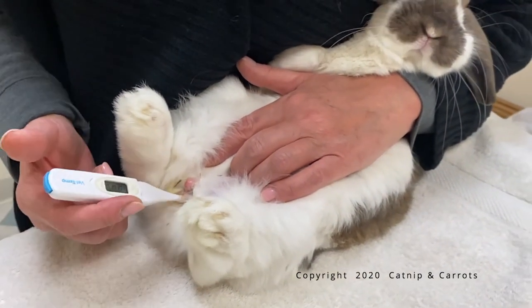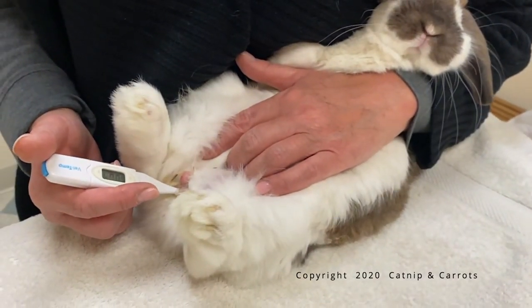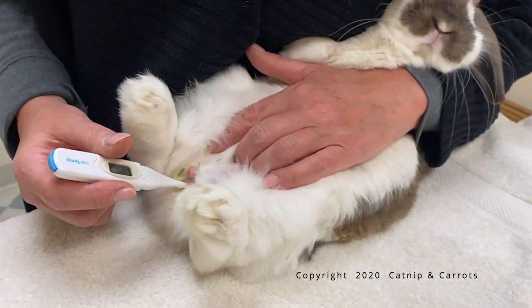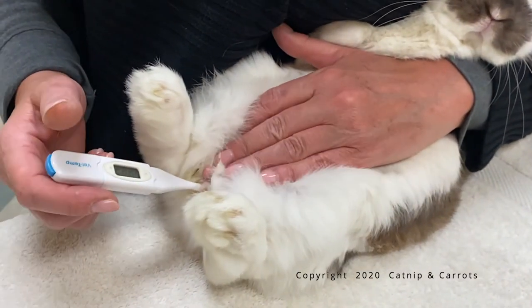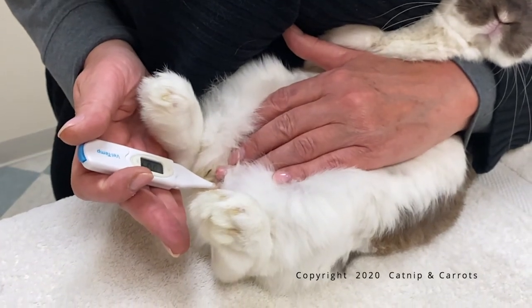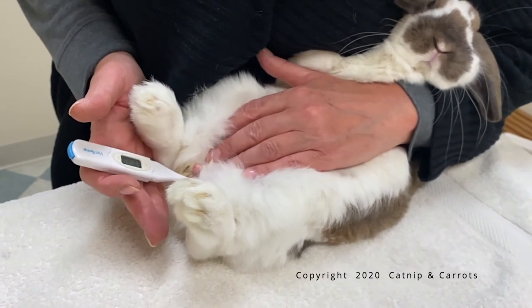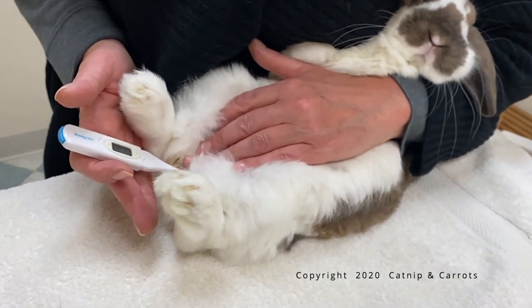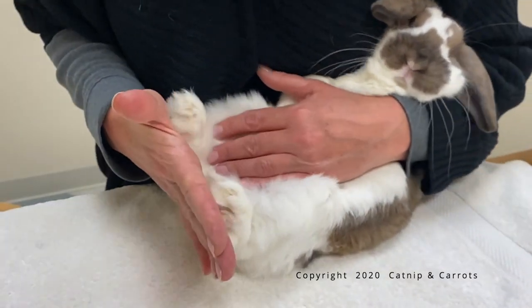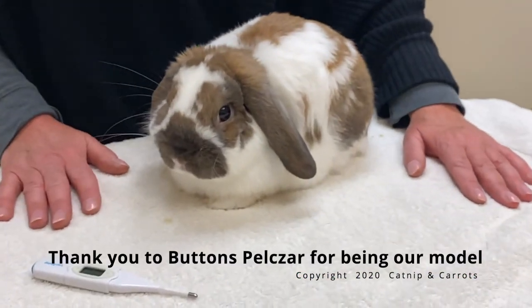The numbers will start to go up as it registers. Sometimes I gently pull and push to make sure the lube is all the way in. We're creeping up towards 101, which is normal — 100.8, so he's a little below. Out the thermometer comes, and then I make a plank out of my hand and right hand back up.